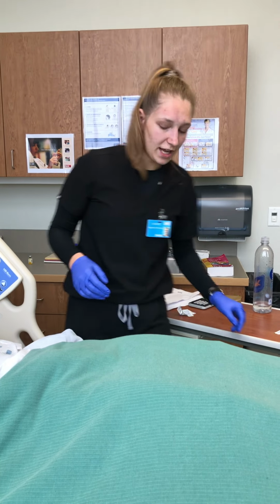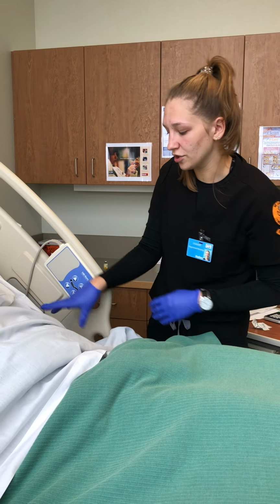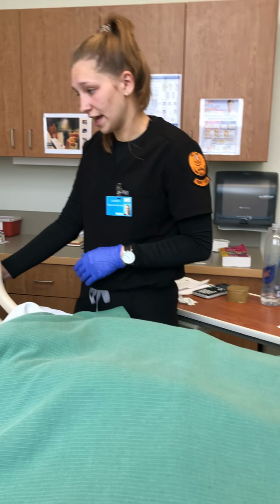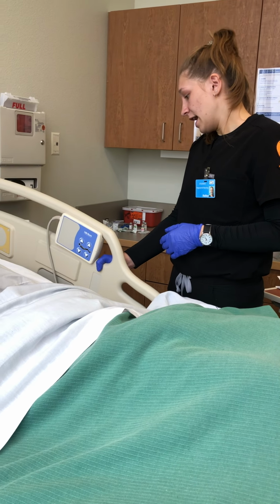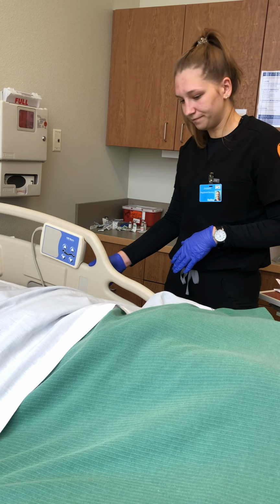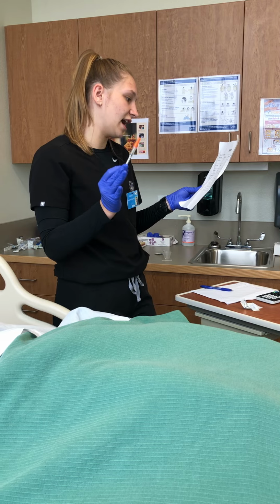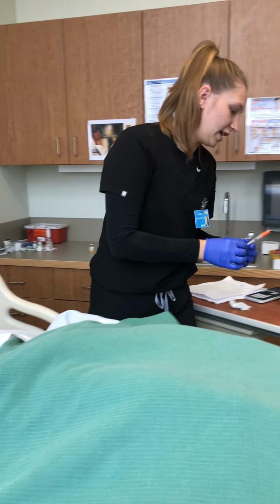Okay, so next we're moving on to your insulin, because I understand that you are newly diabetic and your blood sugar is currently sitting at, I'm going to lay you back, your blood sugar is currently sitting at 240 and we'd like to get that down. So I'm going to go ahead and administer to you insulin. We have 25 units of it, and this is hopefully going to help get your blood sugar down and get you feeling all good again. I'm going to be administering this in your abdomen. So I'm just going to do my third and final check of the insulin, and I have 25 units in here, 9 regular, 16 NPH, and I have 25 units in the syringe. So that's my third check.